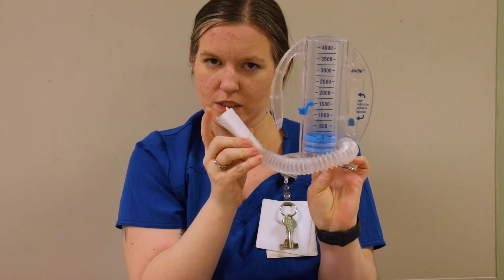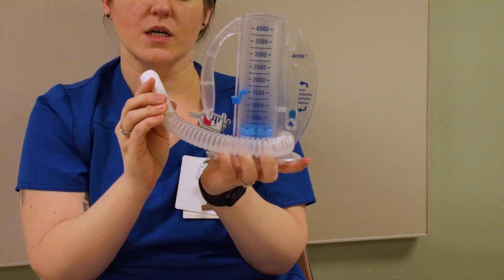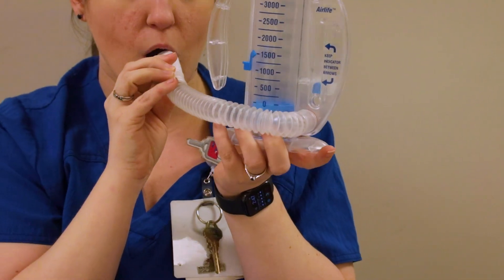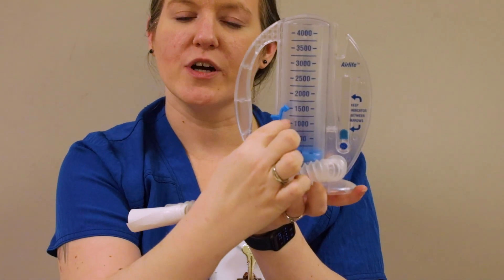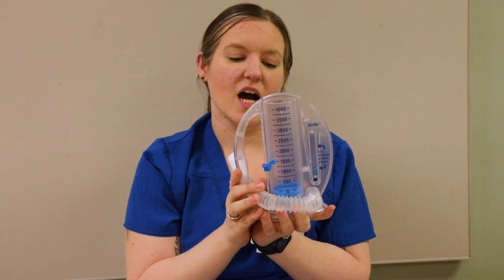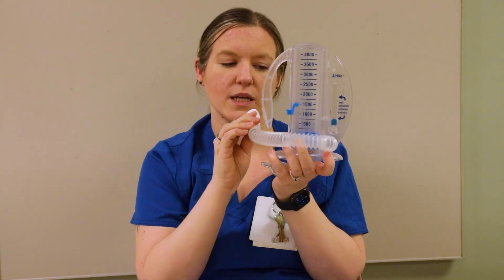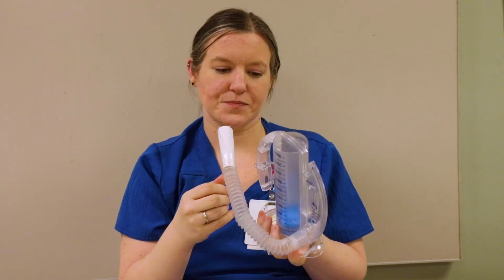I'm going to demonstrate with it facing you so you can see what it's doing — normally the patient would have it facing them. Have your patient take a breath out first, and when they breathe in, they breathe in through the mouthpiece. Make sure they don't blow into it. That rose up to 1,500, so when you document, you would say they got up to 1,500 on their incentive spirometer. It's recommended to do 10 breaths every hour. Some patients struggle with that, so I tell my patients to do two or three breaths every commercial break of their show.